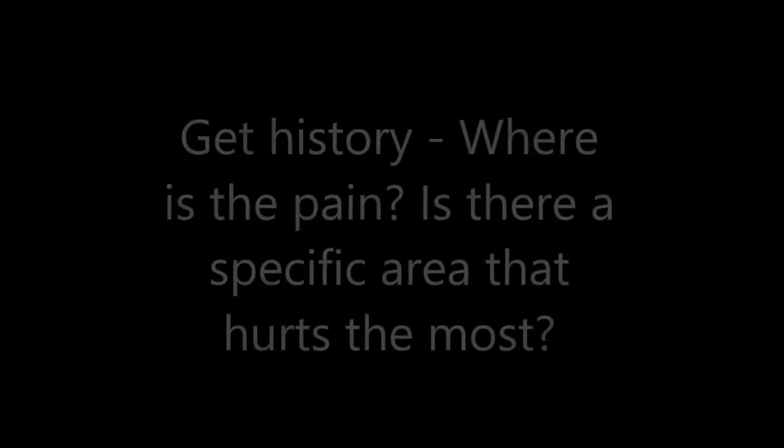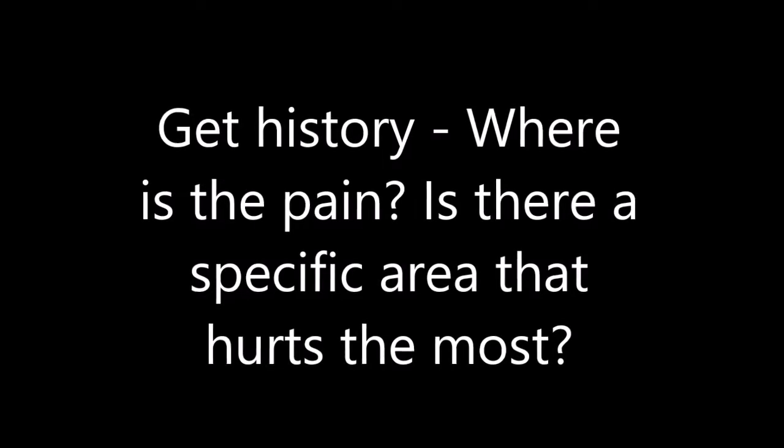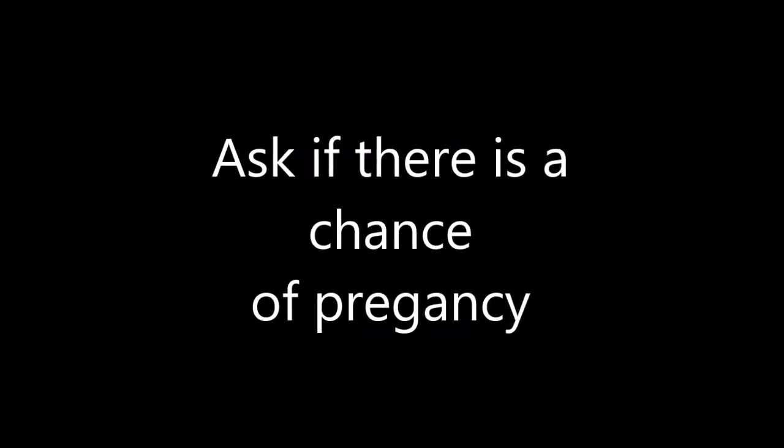After the room is all set up, I go out, get the patient, introduce myself, and verify information and the doctor's orders. Once the patient is in the room, I will ask about history. I will ask questions such as, where's the pain, which side, and is there a specific location that hurts the most? I will also ask how long they've had the pain for, and if there's any chance of pregnancy.